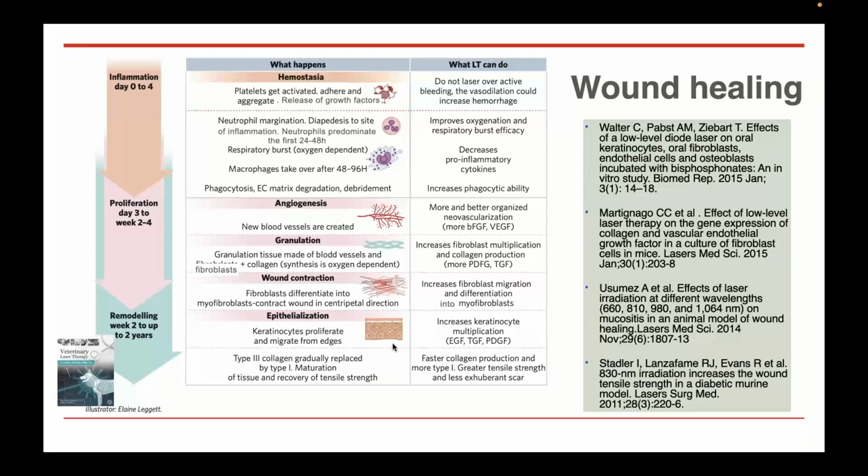So the tissue is not going to experience abnormal changes, but it's going to have a metabolic engine that is working faster and that has more fuel to do it in the form of more blood flow and more oxygen. So the result of treating wounds with laser therapy is that they heal faster, with less inflammation, less risk of complications, and with a resulting tissue that has more tensile strength, between 20 and 60% more, depending on the paper.